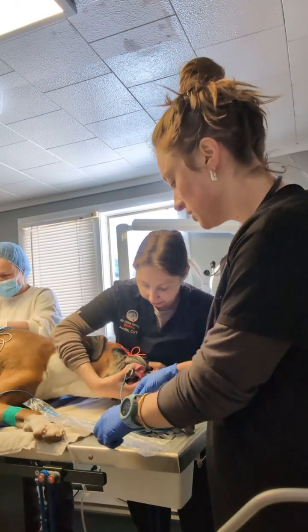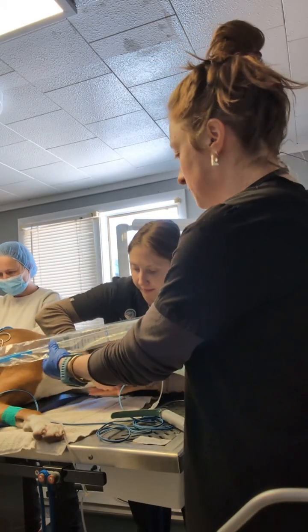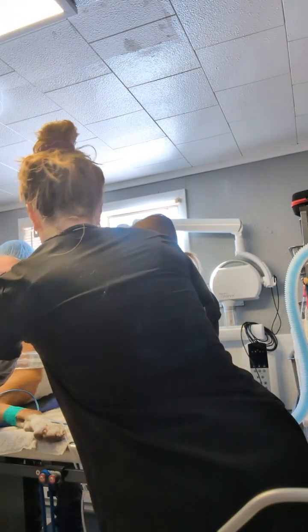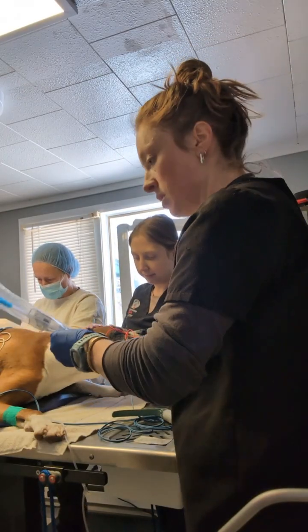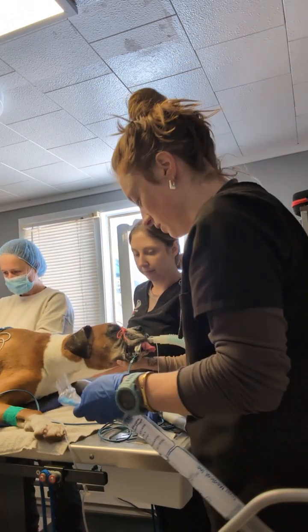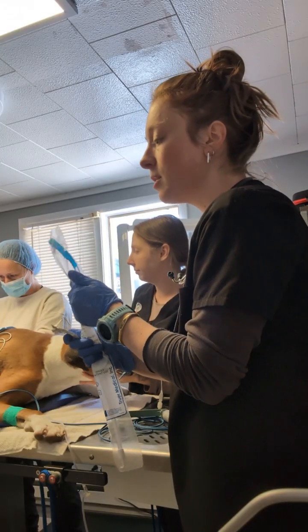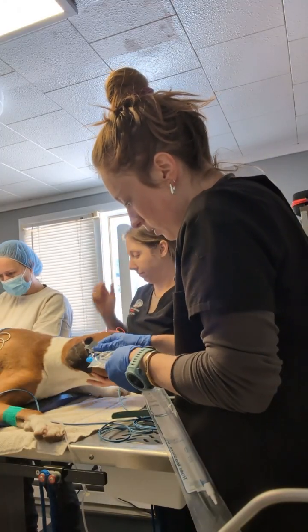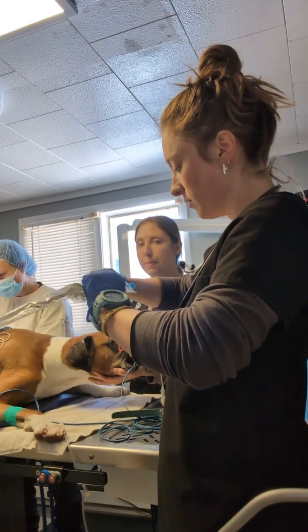Okay, so for the esophageal stethoscope, I want to measure it from his mouth and ideally to the 5th rib. That way I have a good idea of where it will be sticking out. So this will be just long enough for him. I've got some sterile lube that I'm going to apply to the tip. Fifth rib or base of the heart, anywhere in there is great.